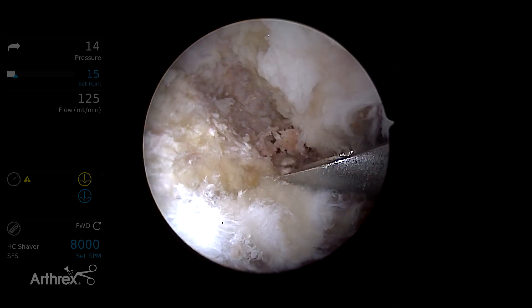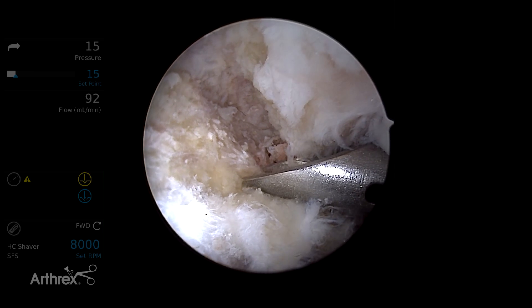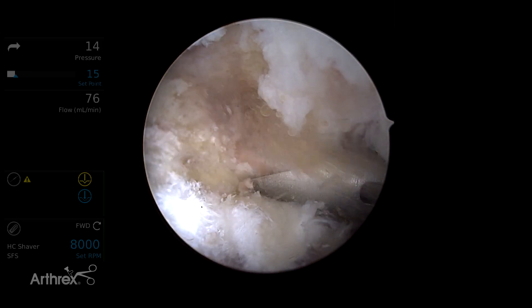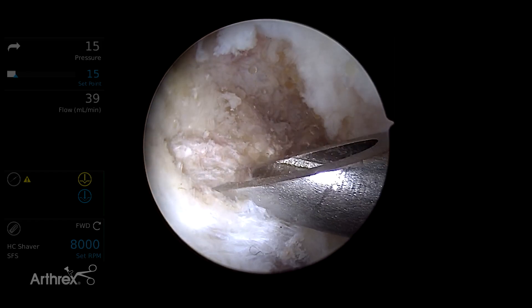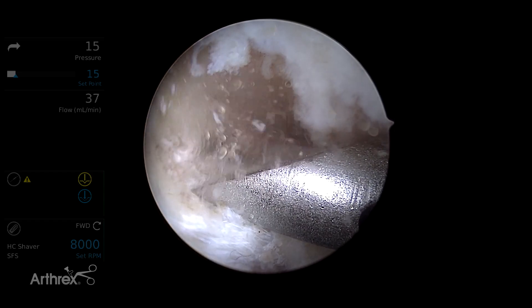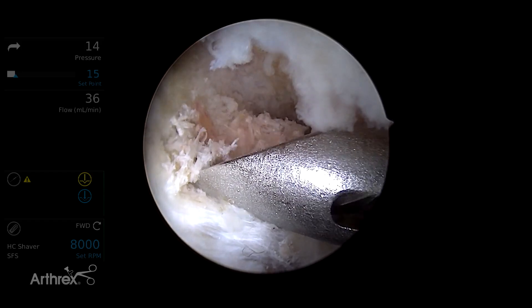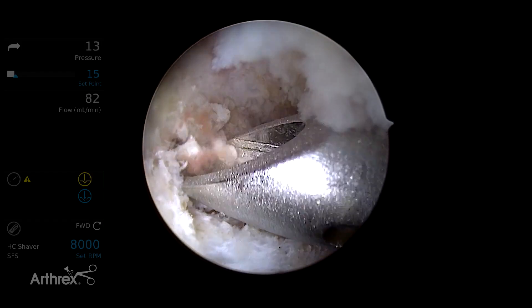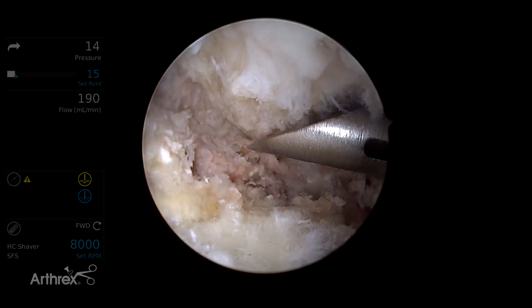The drill comes in oscillating, and we're going to drill all holes at the same time. We advance for our second hole and then our final anterior hole position. Knowing where the psoas recess is, we drill and avoid violation of that recess. The drill is then removed, and the guide can be utilized effectively as suction to remove the bone debris from the pre-drilled holes.